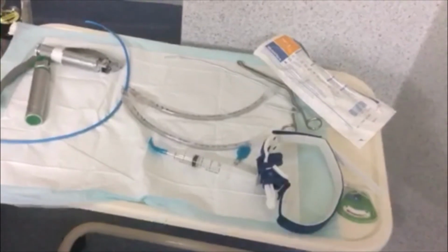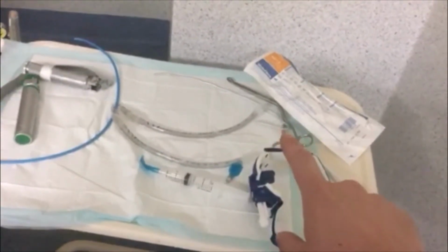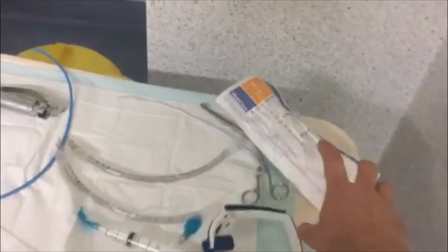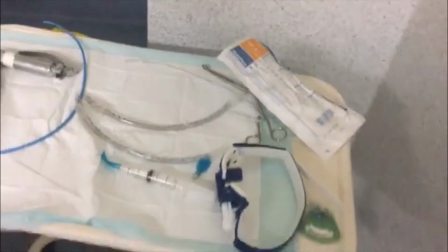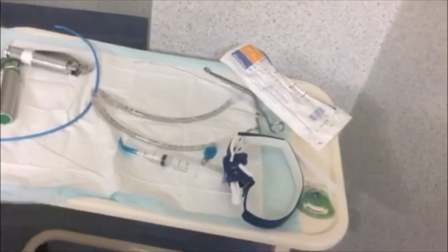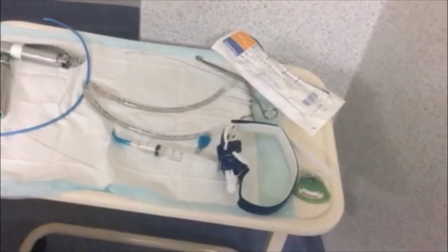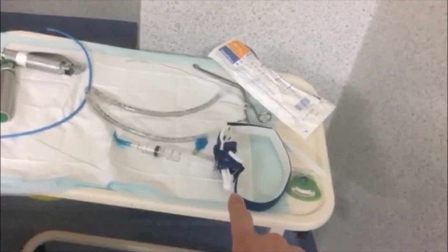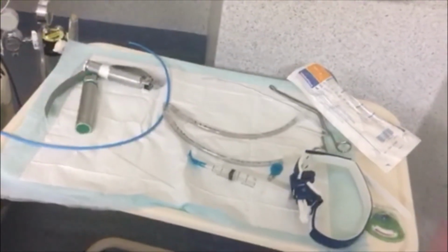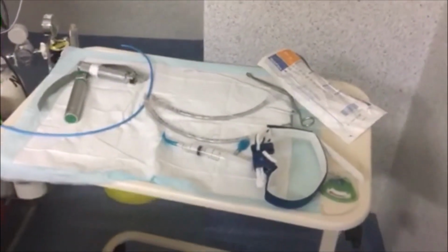Doesn't have to be connected, but cuffs checked as well. We've got a stylet just in case we need it, Magill's forceps. We've also got an LMA just in case for an emergency if we have a failed intubation. We've also got a manometer on the side here to check our cuff pressure afterwards, and also a tube holder. And hopefully our airway assistant is competent in doing the railroading of the procedure.